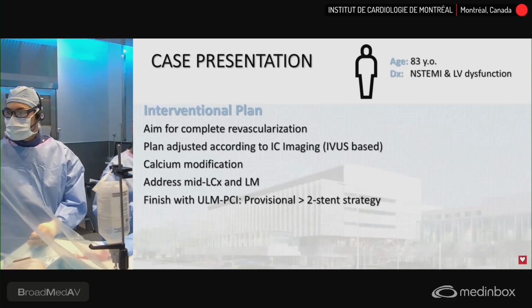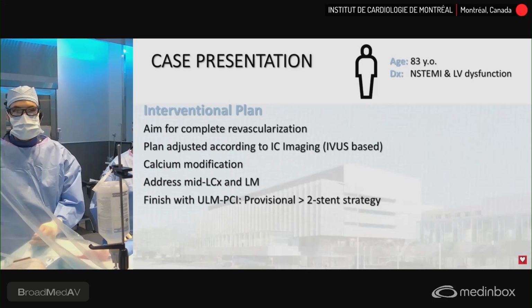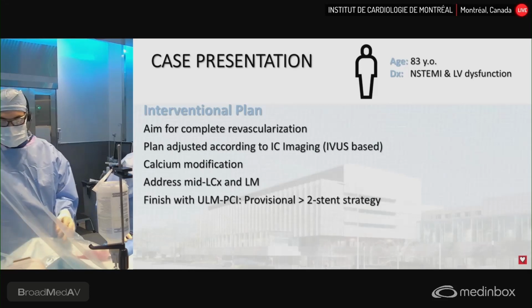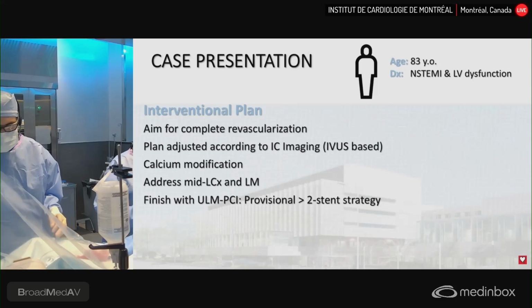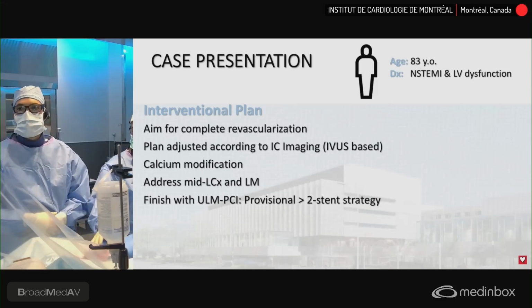Now we would like to complete the revascularization. There's the left main, you saw, I think, distal left main, as well as the circumflex that has 2 stenosis. And at some point, Dr. Avram will tell you how we wired that because it was technically challenging. Had to use a SuperCross, but we'll discuss that in a few minutes.